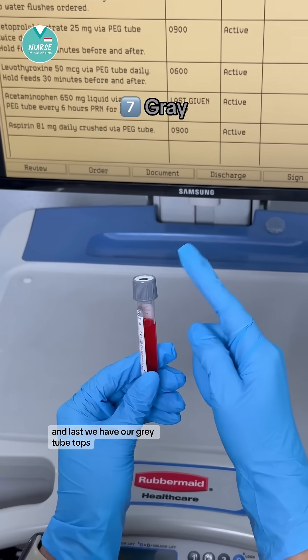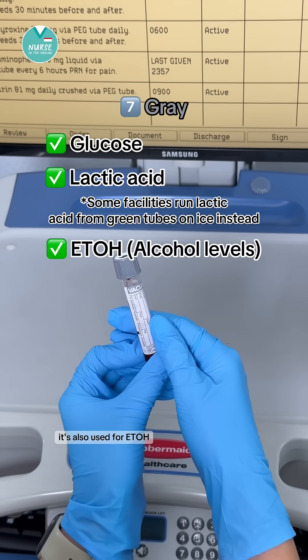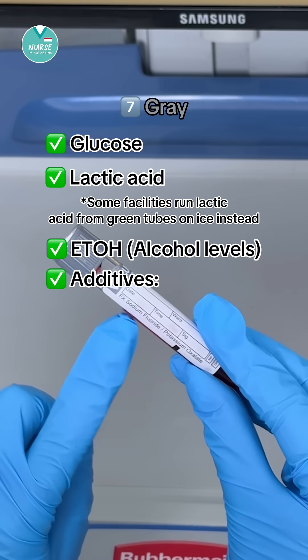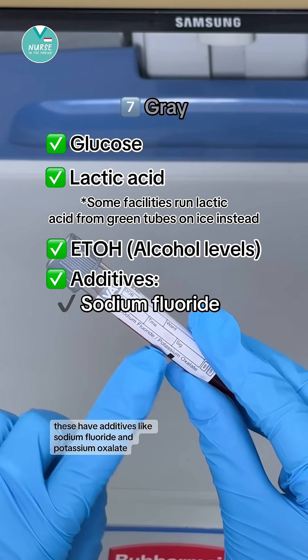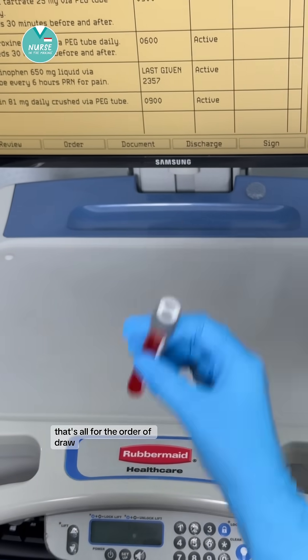And last, we have our gray tube tops. This is used for glucose and lactic acid, and also for ETOH or alcohol levels. These have additives like sodium fluoride and potassium oxalate. This requires eight to ten inversions. That's all for the order of draw.